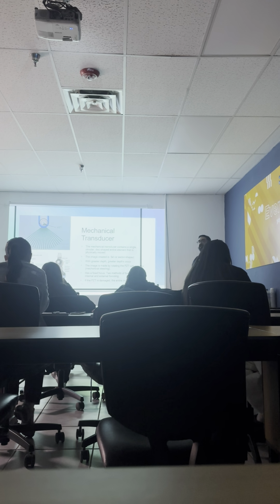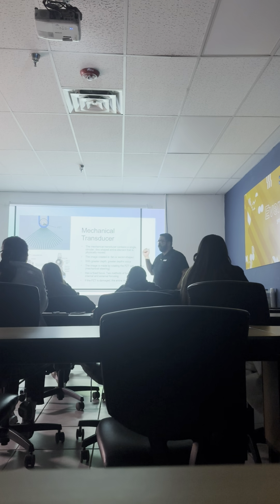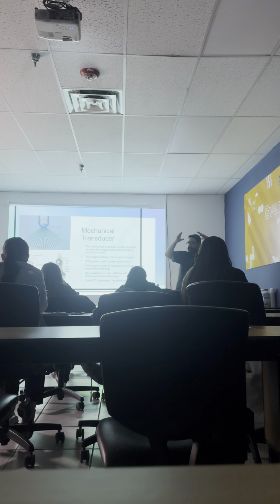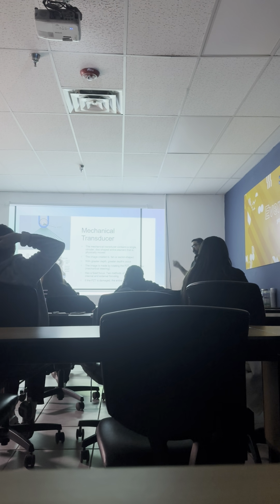Okay, so let's say that I want to steer my beam to the left or steer it to the right. Is there something in the transducer that does that for us when we're imaging? No, not the acoustic lens. The crystal is not mechanically steered, it's electronically steered, okay? This one is the actual crystals moving from side to side. So what else do we want to move when we're talking about our sound beam? The focus. The focal point, right?